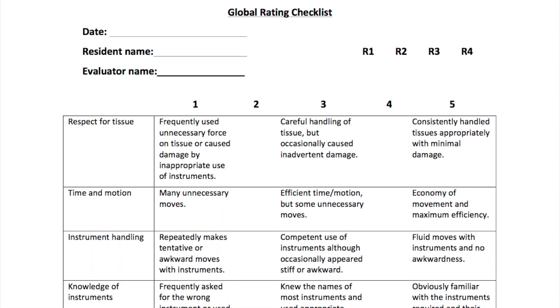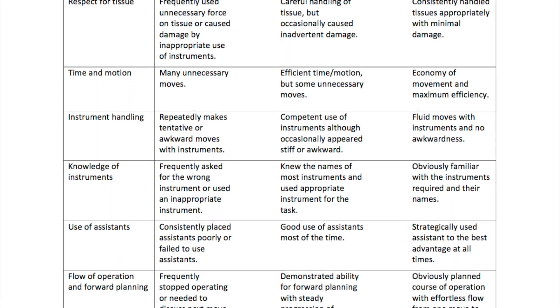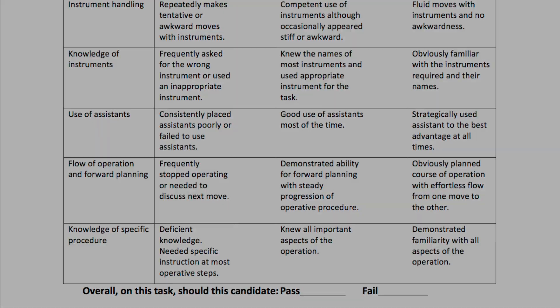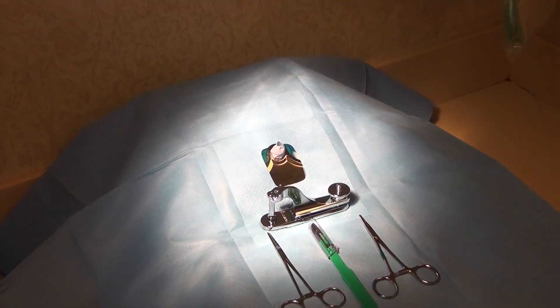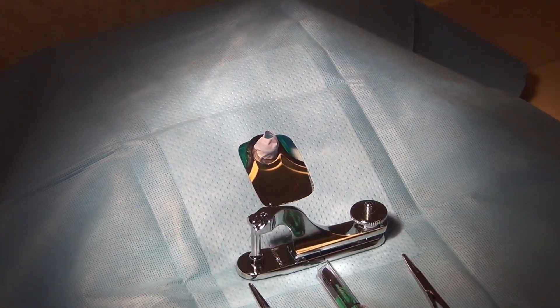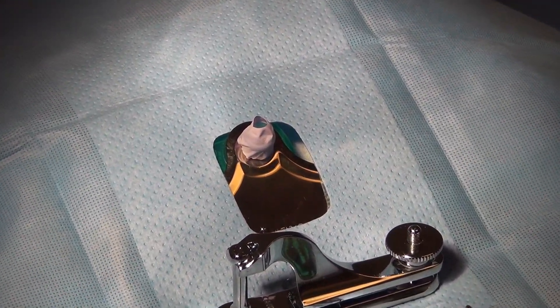We use an evaluation tool to document learned proficiency with both techniques. Thank you for taking the time to watch this video on construction and use of a neonatal circumcision model.